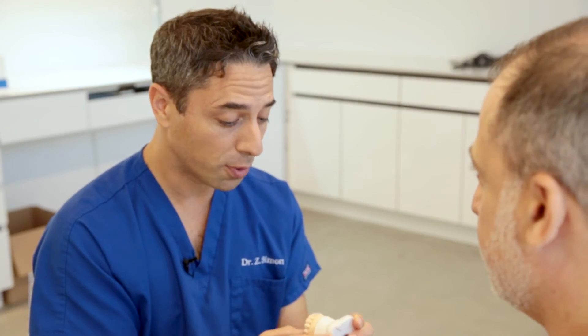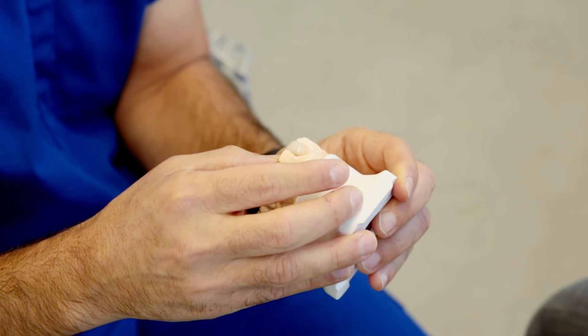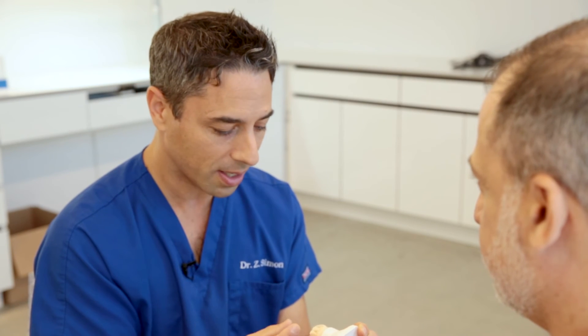Sam, this is a beautiful restoration — actually much more beautiful than a lot of the permanent restorations that I see. How did you get the lifelike appearance of the provisional? It's really standing out like actual tooth enamel. How does that work?